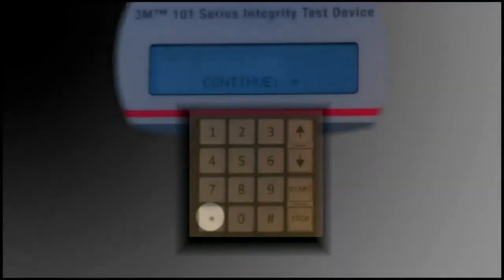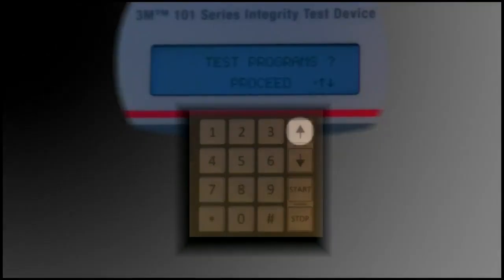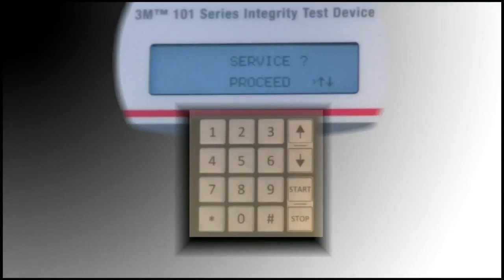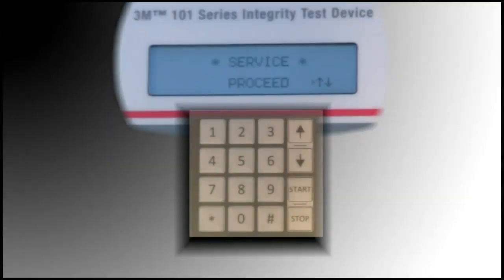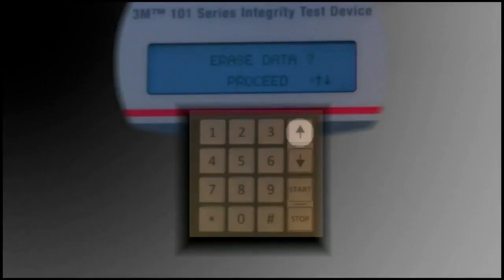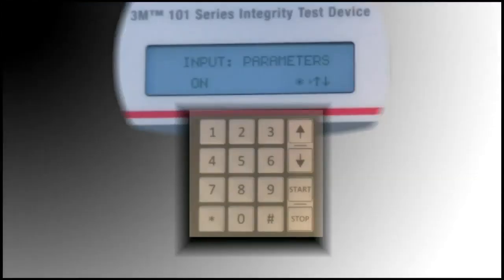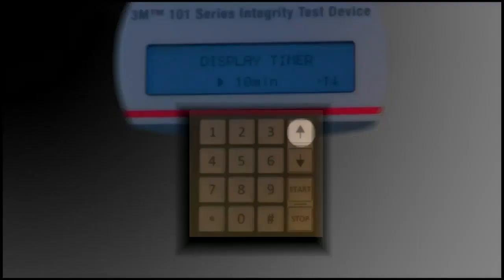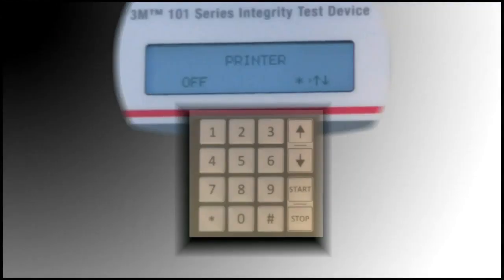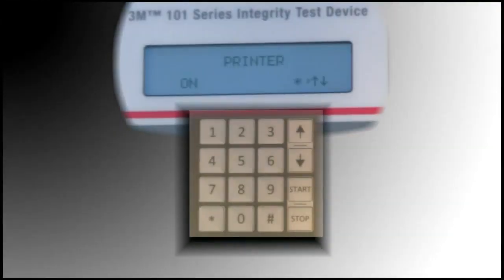Activate the test device and scroll to the Service menu. Press the Start button on the device keypad, then press the 7 button. Press the up arrow 7 times, then press Start. Press the up arrow 8 times. Press the star button to toggle as needed to ensure the printer is on.